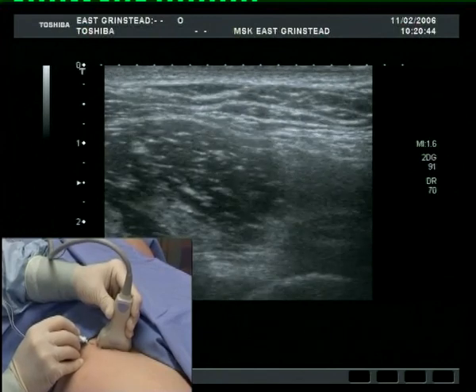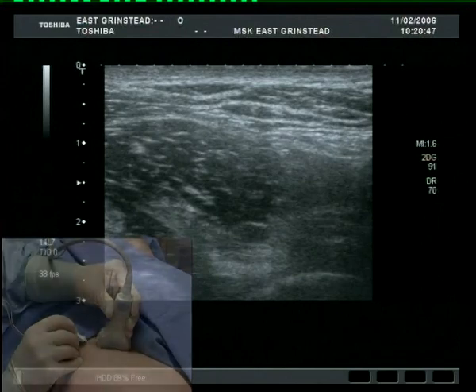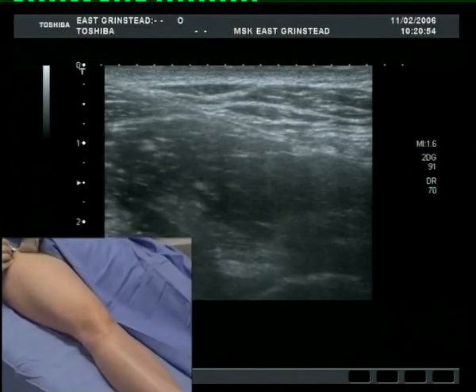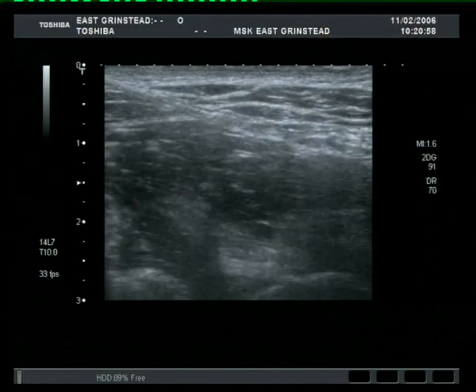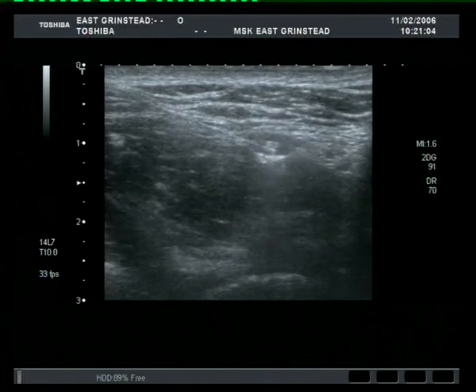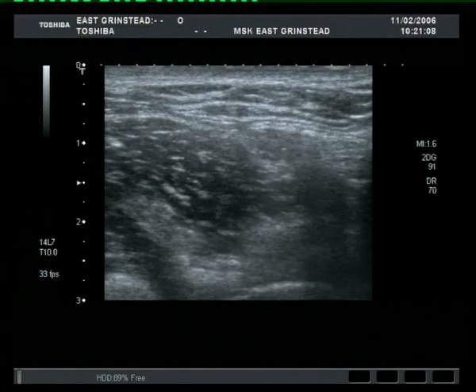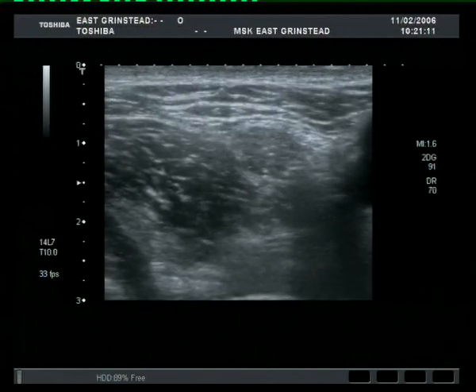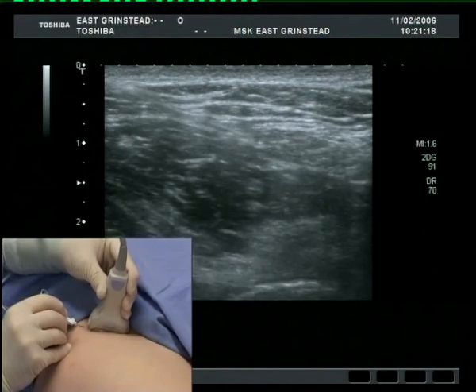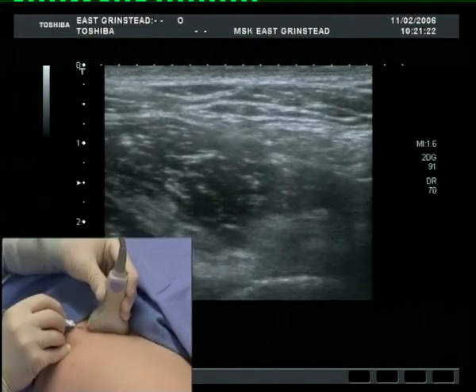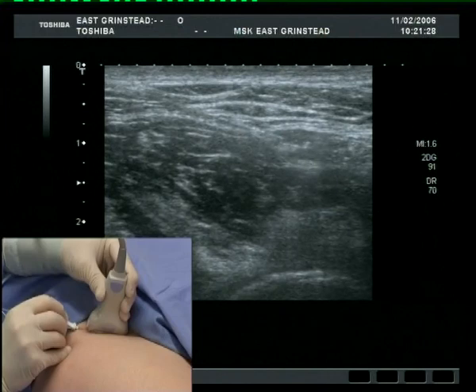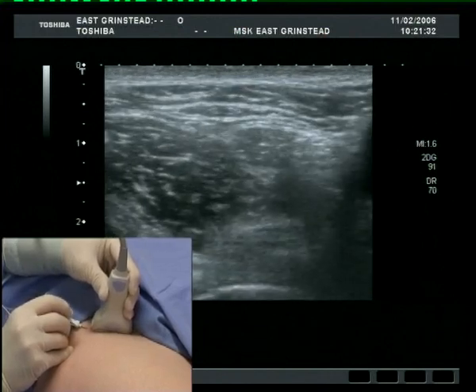A nerve stimulator is used here for demonstration purposes only. The needle is advanced towards the posterior aspect of the femoral nerve. A small test injection of one mil is made.